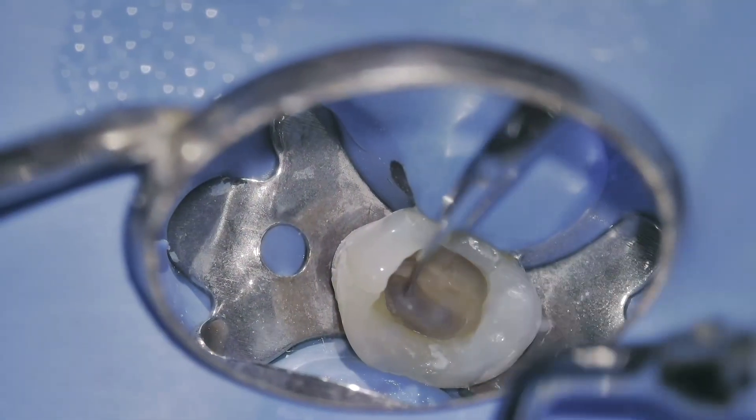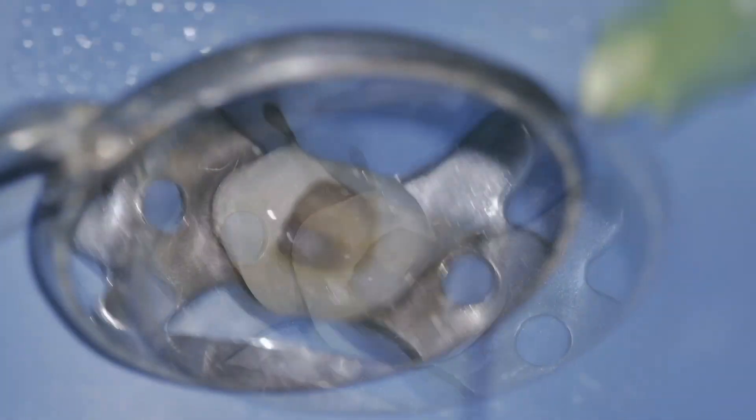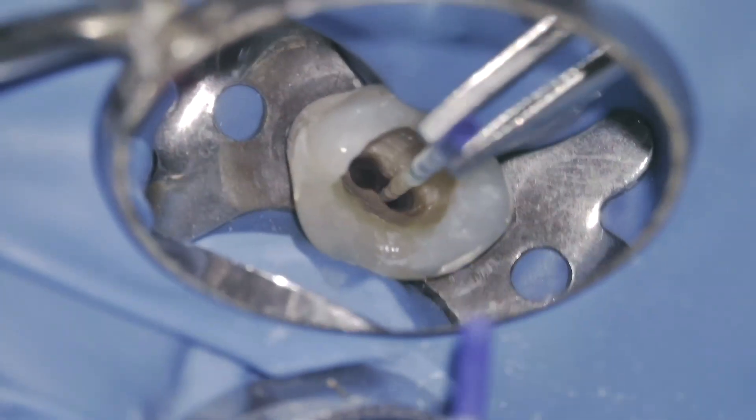To enhance the disinfection process, I activate the irrigant using an ultrasonic device. This step improves the penetration of the irrigant into lateral canals and irregularities within the root canal system. Ultrasonic activation ensures more effective cleaning, which is critical for successful endodontic outcomes.